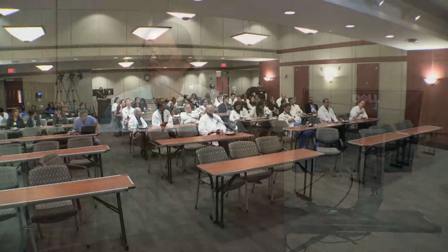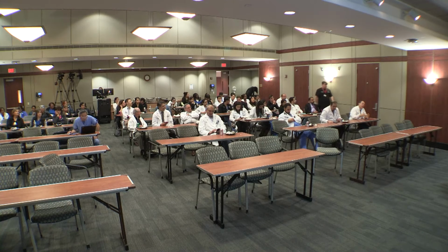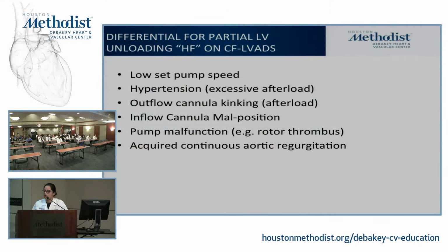No long-term data. As far as cath data, is there anything that shows what these changes in RV shape correspond to in terms of PA pressures, RAP? So, when the changes in the RV occurred, there was one paper, a very small study, where they said that if the RV shape changes, these patients also tend to have more mitral regurgitation and higher PA pressures, and hemodynamics were not adequate, so the wedge pressure stayed elevated. But there is some link there, though it's not over the long term, like many years, to say whether it's better or not.